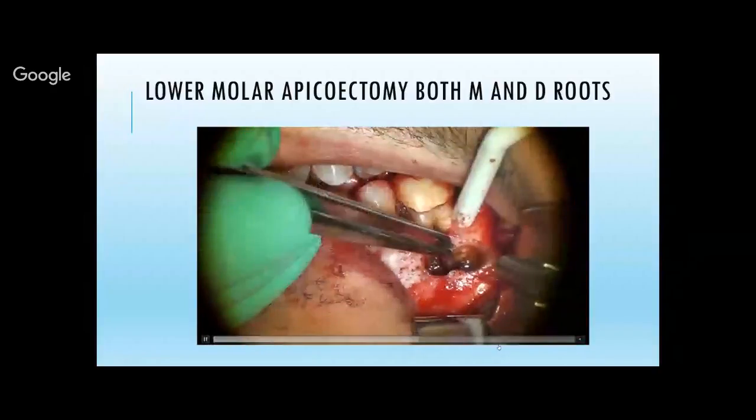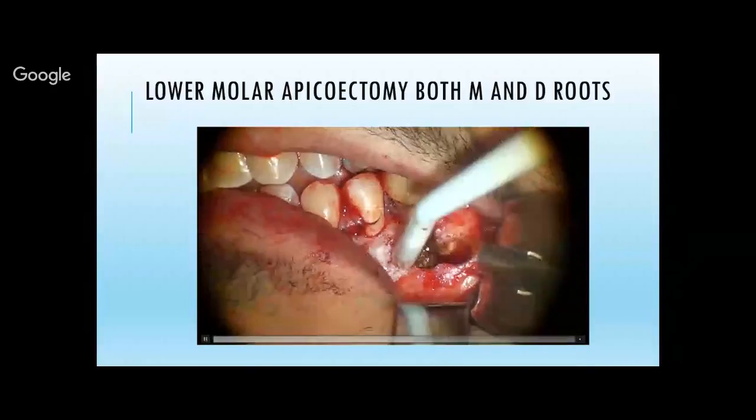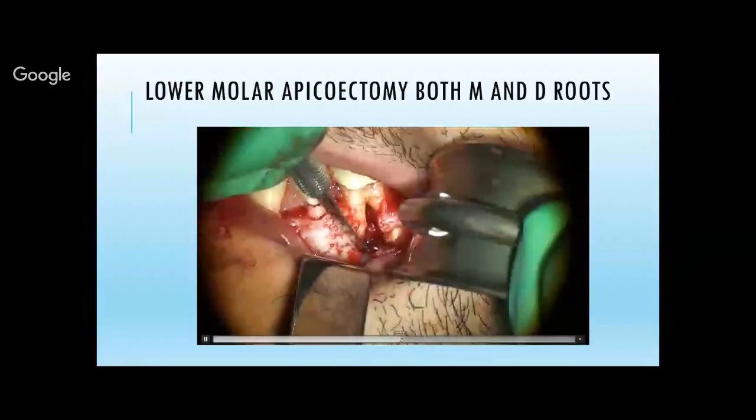Here, I'm gonna bring this back just a little bit. So this is the new gauze strip that I told you guys about. I'm sorry.